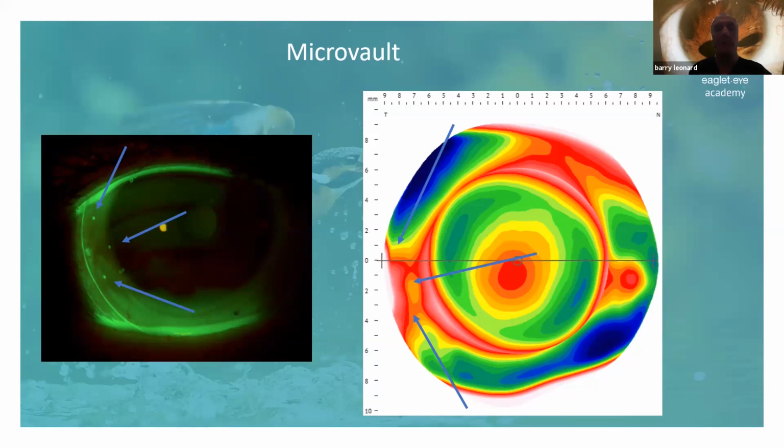If you're not familiar with the microvaults, they put those around so we can see where it lands. And boy, it hit bam right on. And that little bit of impingement that she had, which was bothering her, was taken care of in both eyes. So we had, in this case, first lens success as far as sagittal height, APS, everything.